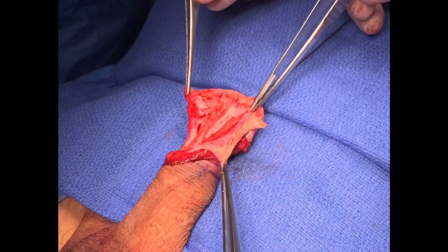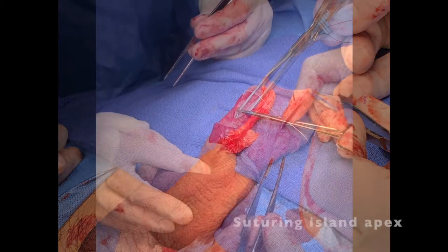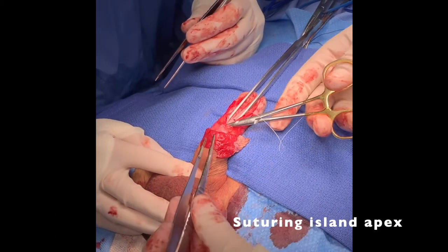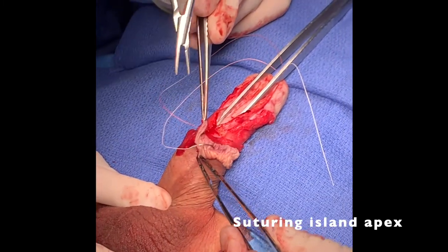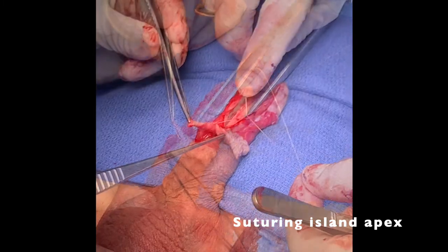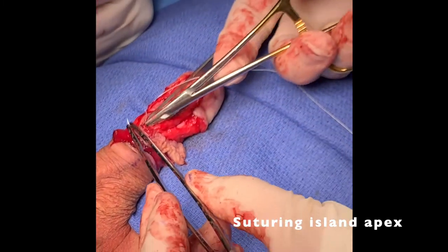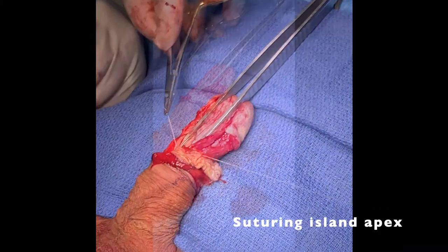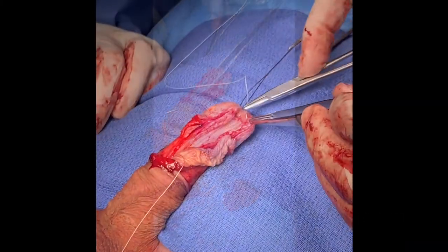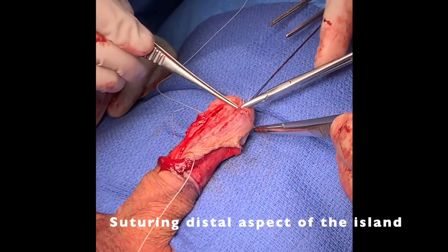We then transposed and inverted the transverse island flap into the urethral defect. Starting at the apex, the transverse island flap was fixed to the native normal urethral mucosa using 5-0 vicryl interrupted sutures. The island flap was secured distally with interrupted 5-0 vicryl sutures.